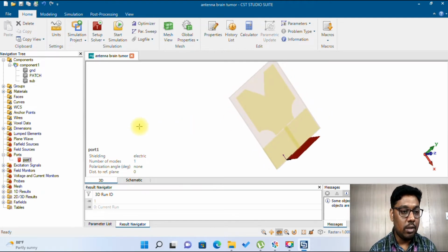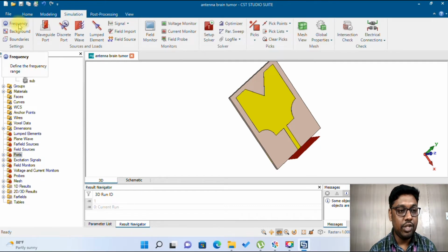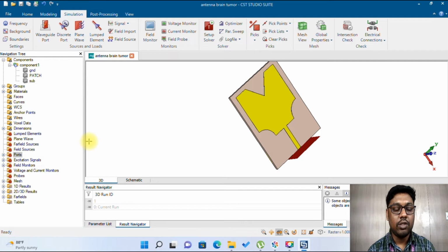Now we will discuss the result part. Once we completed the design, we go for the simulation. Here in the simulation tab you can see the frequency range, the band of frequency that I took, is around 1 to 8 gigahertz, which covers most of the UWB.